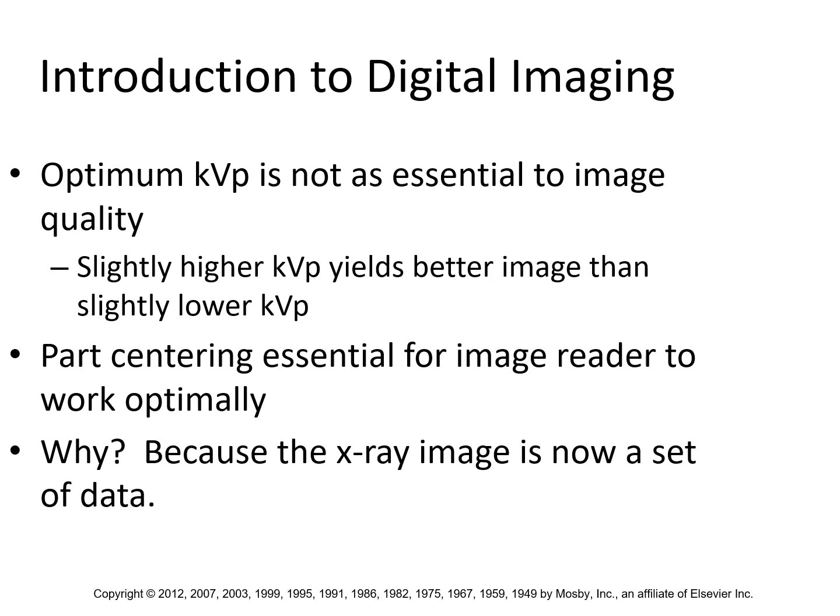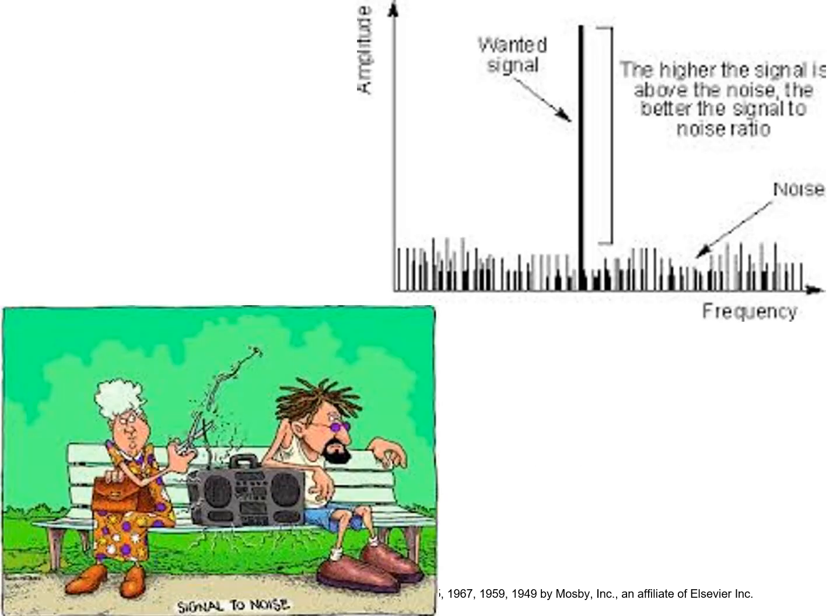always remember that the X-ray image becomes, as soon as the exposure is over, a data set. It's no longer X-ray photons. It's a set of data. Okay, it is pixel intensities. Those pixel intensities are processed and slightly modified and then ultimately displayed. All right, but it's a data set. As soon as the exposure is over, the image is a data set.